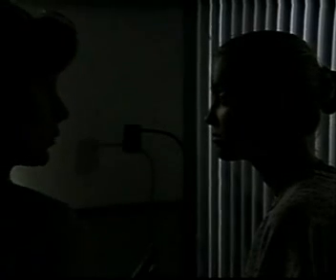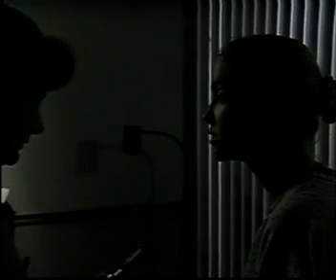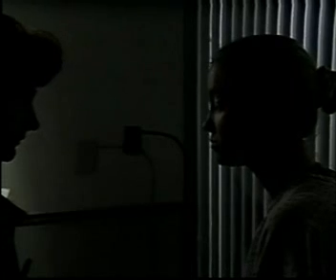Using your left eye and left hand, examine the patient's left eye. From 15 inches away and 15 degrees lateral to the patient's line of vision, shine the light beam on the pupil. Locate the red reflex, which should appear as an orange glow in the pupil. Note any opacities that interrupt the red reflex.